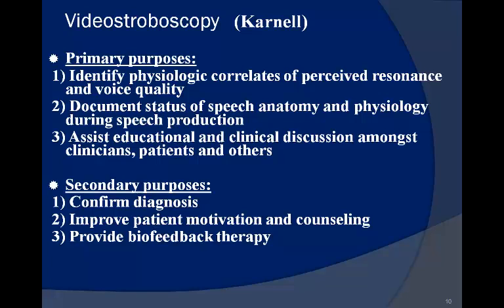In our clinic, we always show patients their exam and explain the vocal pathology and its effect on normal phonation. It helps patients understand their disorder and helps with compliance. Video stroboscopy can also be used for biofeedback during therapy. However, the patient must have a good tolerance for the scope and a low gag reflex for this to be successful.